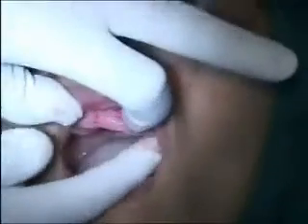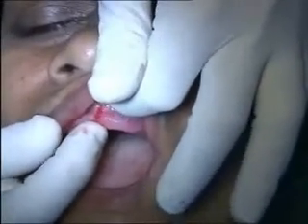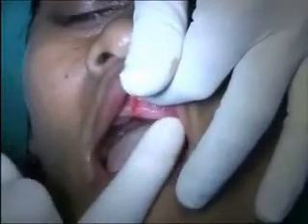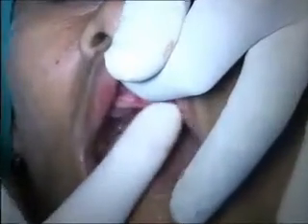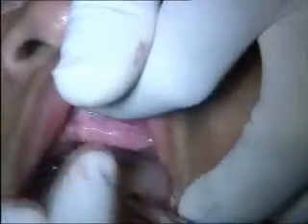Some doctors like to take the incision and go around the whole arch, but I don't think it's very necessary because you're not going to really place anything in the midline. Since you're not placing any implant in the midline, there's no reason to allow the crestal incision to go across the midline. I will bring it here, just to the central incisor area, and I will make a vertical. And similarly on the right side, I will do it in this manner.